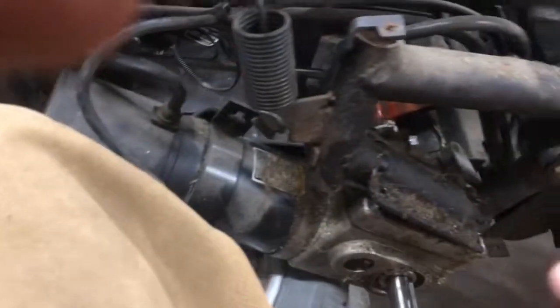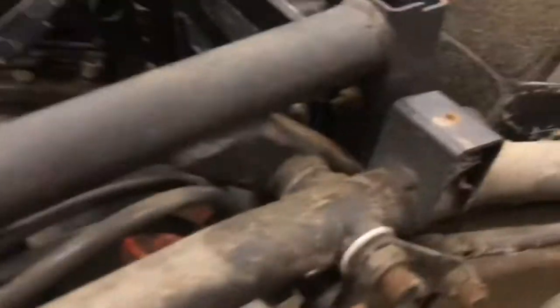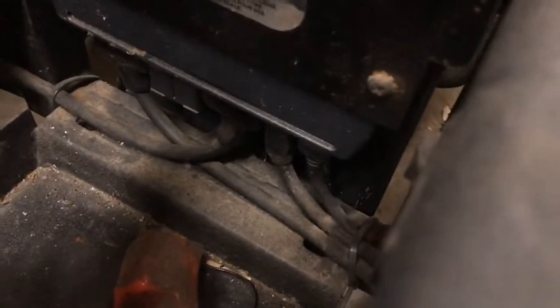Okay. So, we do have a lot of cord to work with. I am familiar with the control box. This is the control box. Those plugs that are under it are where the motor is plugged in. If you're not familiar with it, which you may not be, you could take the foot plate off and then take this cover off.